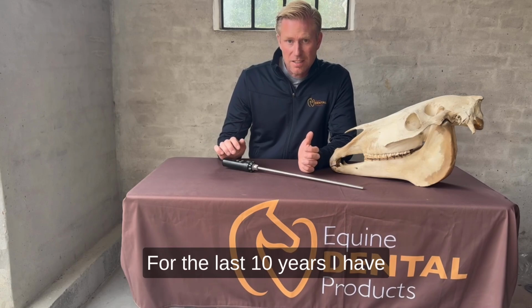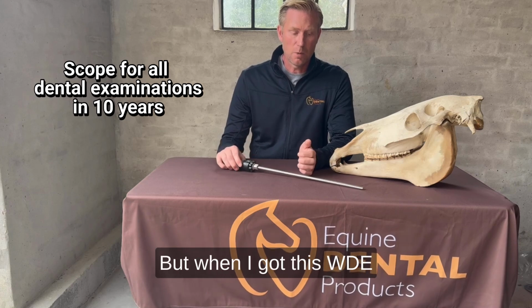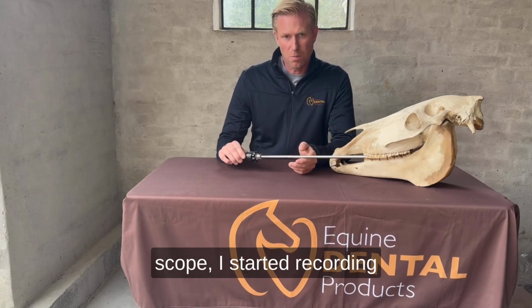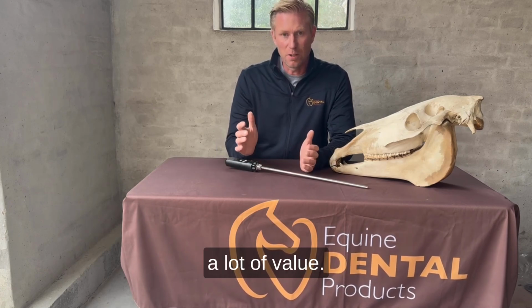For the last 10 years I've been using a scope for all my dental examinations, but when I got this WDE scope I started recording all my examinations, and this gives just a lot of value.